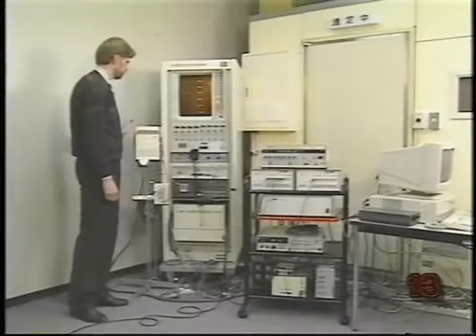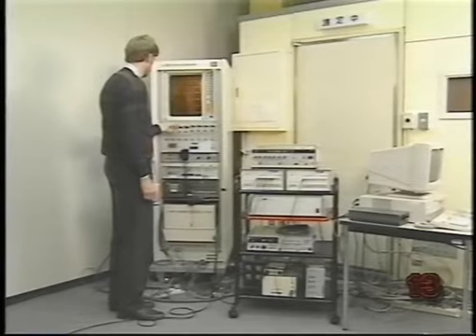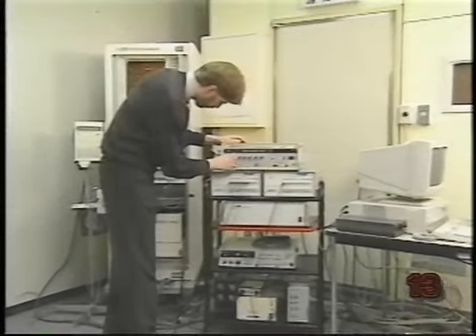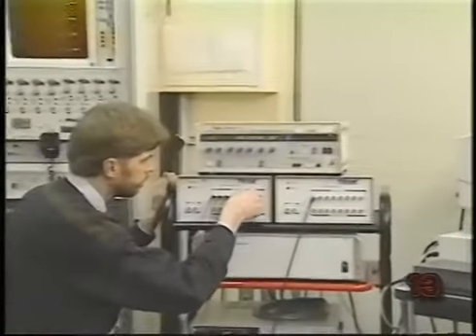In addition to marker position data, optional multi-channel AD converters can be used to record other analog and digital signals, such as muscle EMG, electropalatography, and of course the speech acoustics.